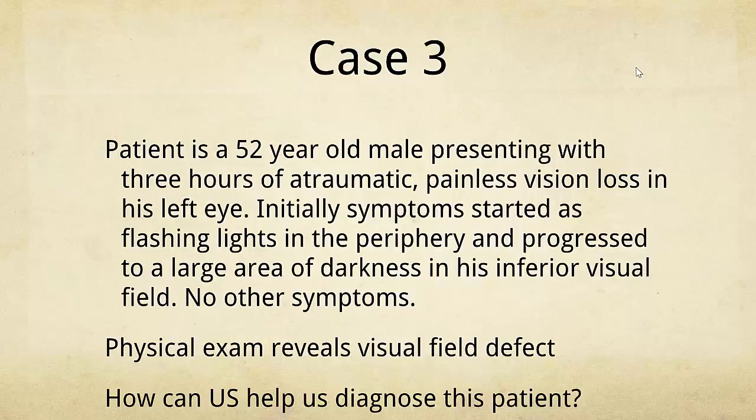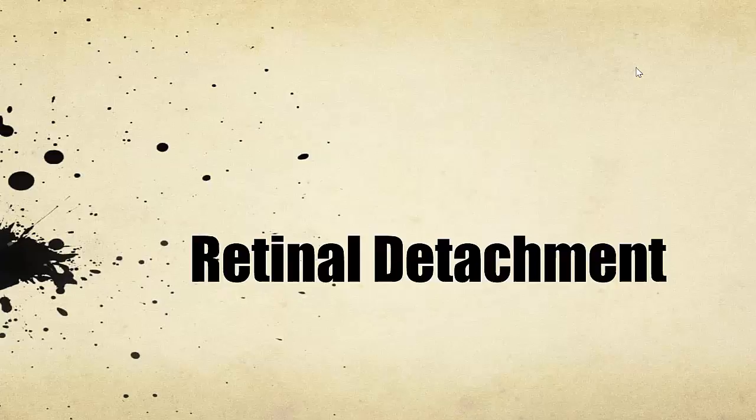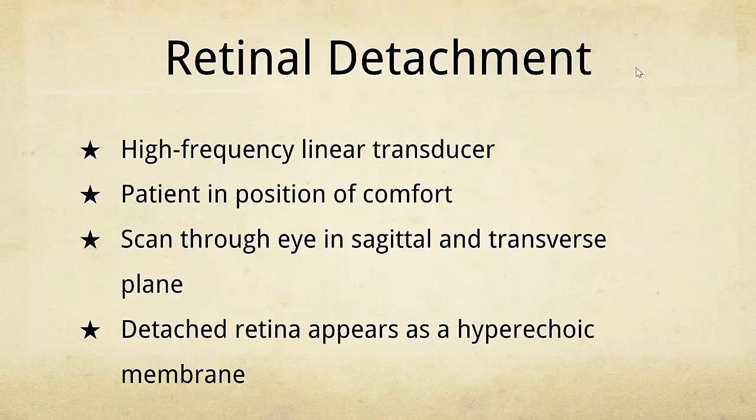And if you've ever actually seen or had an ophthalmology exam for retinal detachment, they do an extensive view of the retina with this little magnifying thing and all this craziness. It's just not something we're going to be capable of in the emergency room. But we are capable of bedside ultrasound. So as you might guess, we're going to talk about retinal detachment.